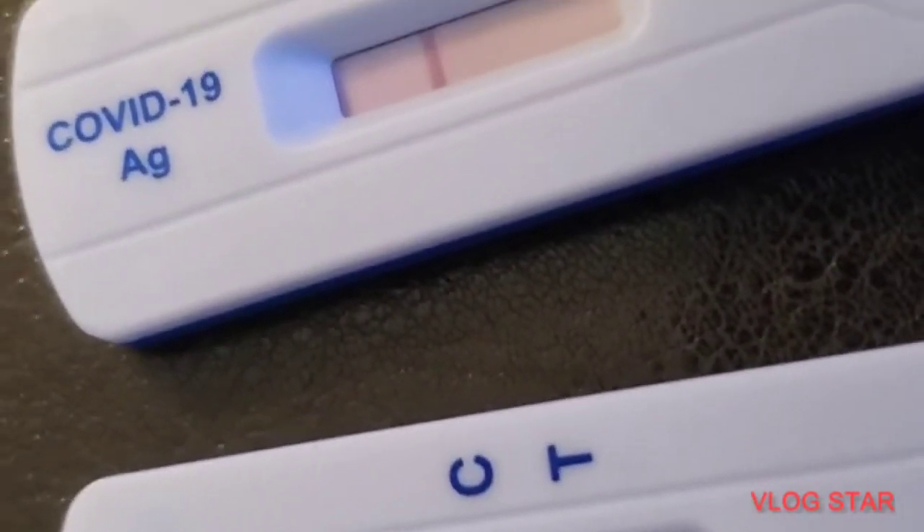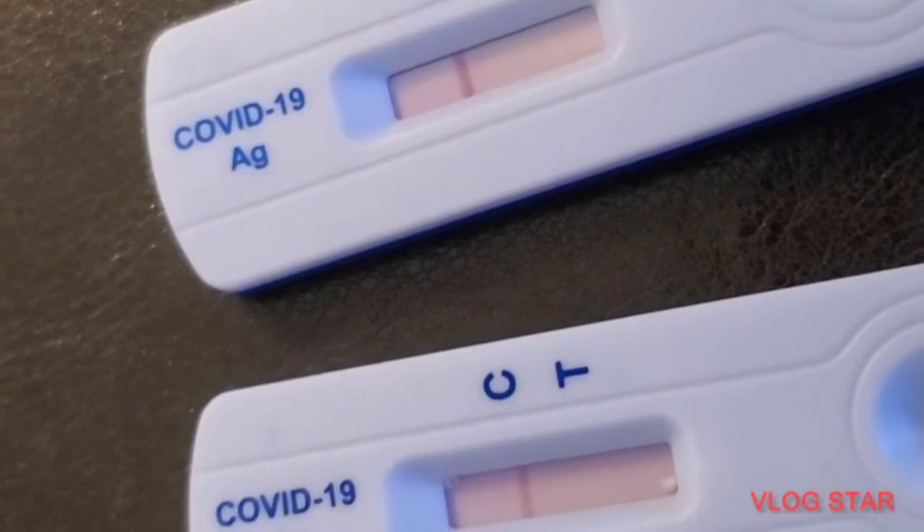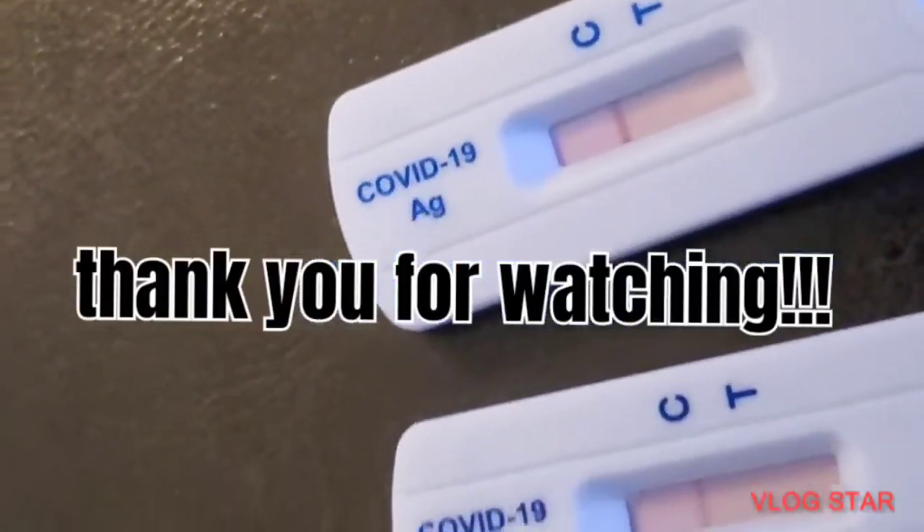Negative. Two lines means positive. One line means negative, right? Correct.